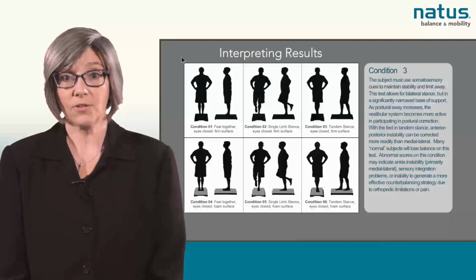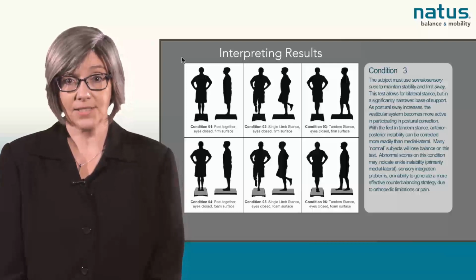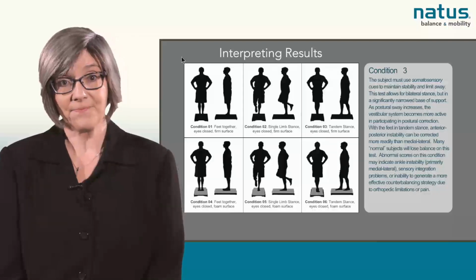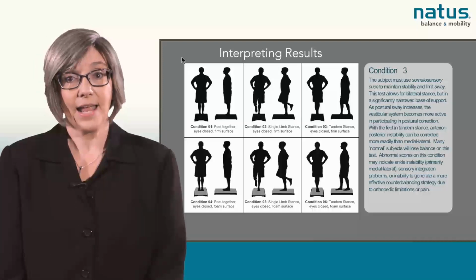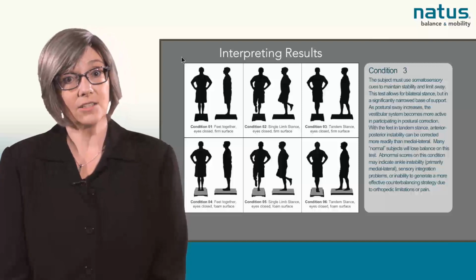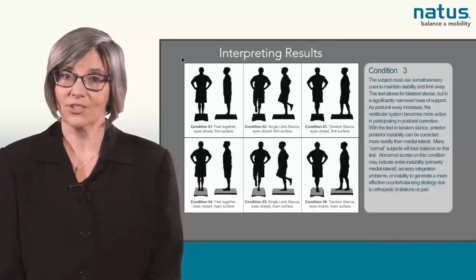As postural sway increases, the vestibular system becomes more active in participating in postural correction. With the feet in tandem stance, anterior-posterior instability can be corrected more readily than medial-lateral instability. Many normal subjects will lose balance on this test. Abnormal scores on this condition may indicate ankle instability primarily in the medial-lateral direction, sensory integration problems, or inability to generate a more effective counterbalancing strategy due to orthopedic limitations or pain.